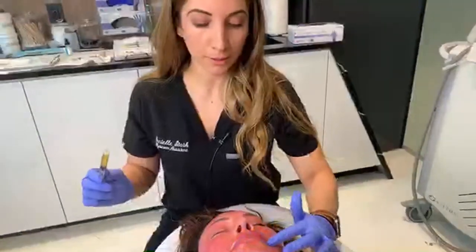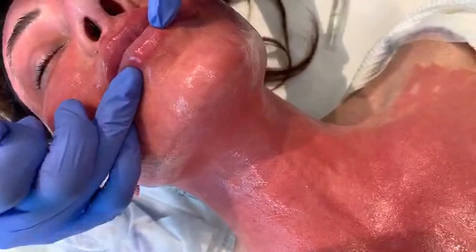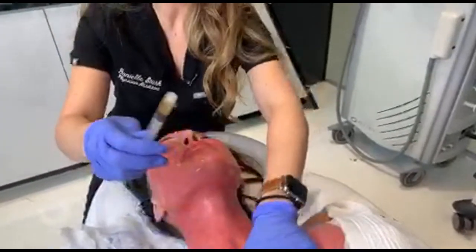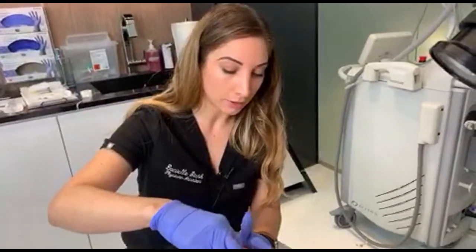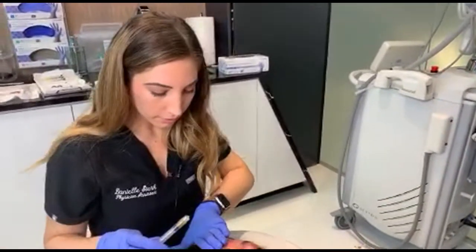The cool thing also about erbium is you could treat, I don't know if you can see it, but we treated right over her lips. So there's all these tiny little white specks, and these are the columns of energy that are going into the skin. So all of that's going to shed and exfoliate. Lips and eyes are very important to address. You can definitely develop lines on your lips. You can develop skin cancer on your lips. So having things that exfoliate that outer layer is really important. Keep everything nice and smooth. Keep the lines minimal. That's great.